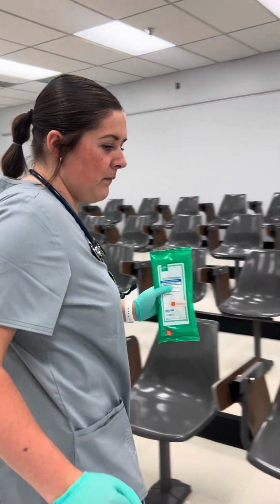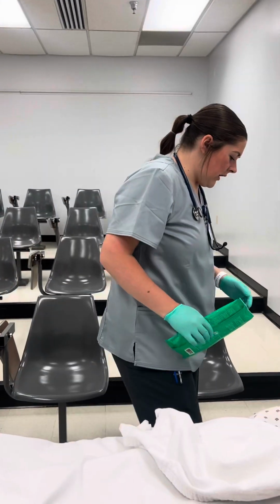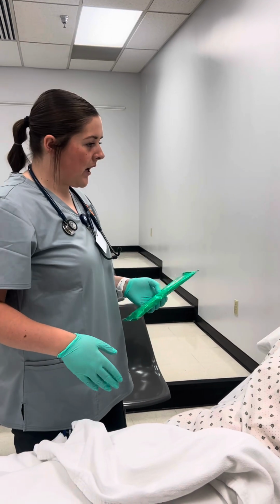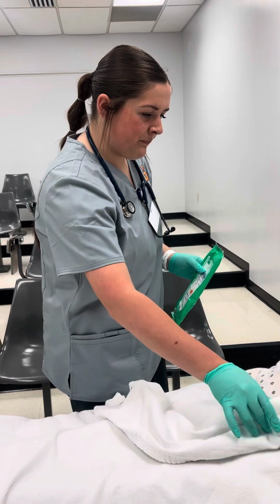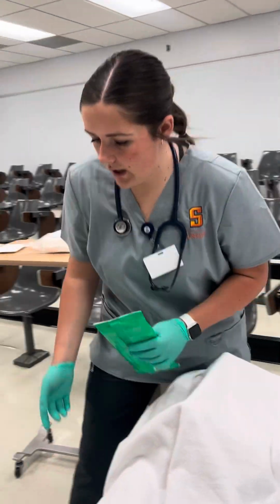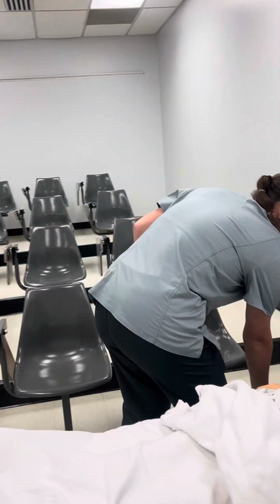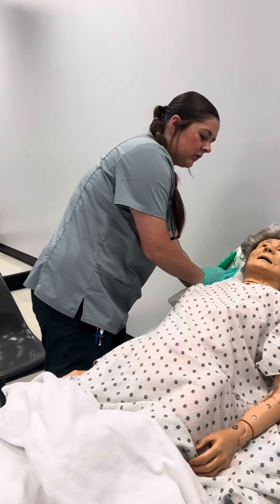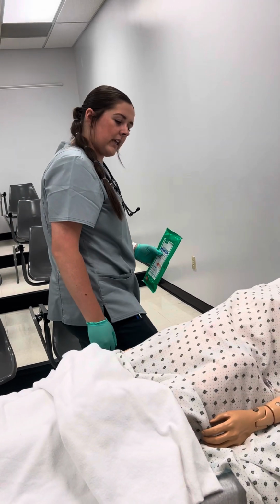Hey Glenda, I'm back. I'm just gonna make sure we have a shut door and curtain. So now what I'm going to do is I am going to clean your peri area, do some peri care before I place your catheter. These are just some wipes, and this is just a cleaning procedure, so we do not need to be sterile right now. But I will walk you through everything I'm doing. If you have any questions, please ask me, okay? I'm just gonna lay down. And I'm gonna raise you up just so it's a comfortable working height for me.